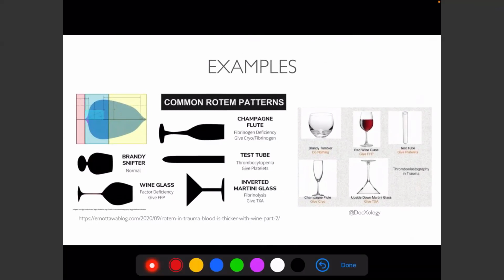Yeah. Sorry, quick question. Antiplatelets applied to neurosurgical procedures. Is there any data on that for using Rotem? No data, but I have an example of that, and I'll talk about it. No data that I'm aware of. And that's something that I think would be almost impossible in the United States IRB system to find. The randomizing you to get DDAVP or platelets or not get DDAVP or platelets if somebody's saying that you might benefit from it with a head bleed. But there's nothing, and I don't think there ever will be in the U.S.